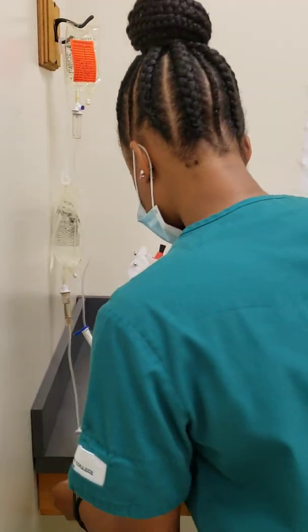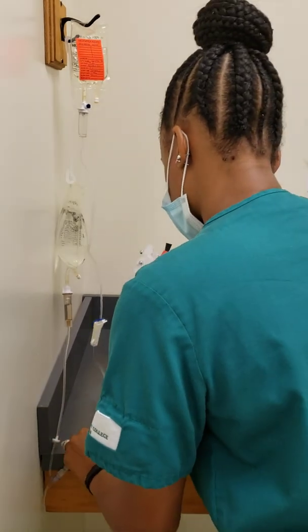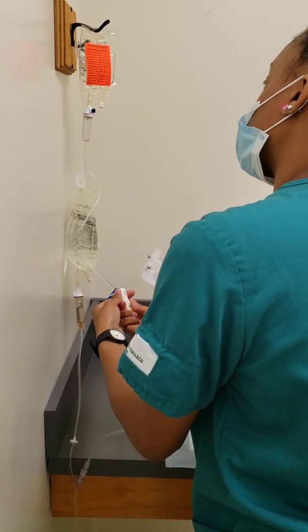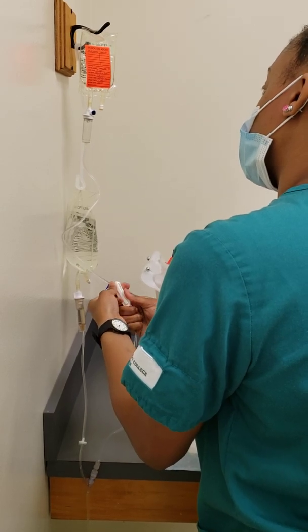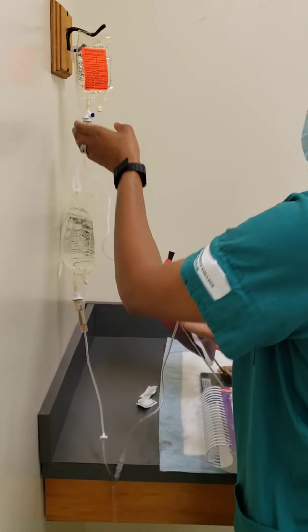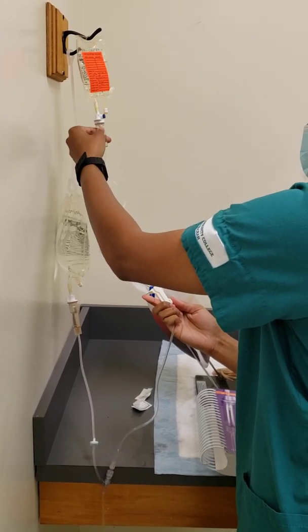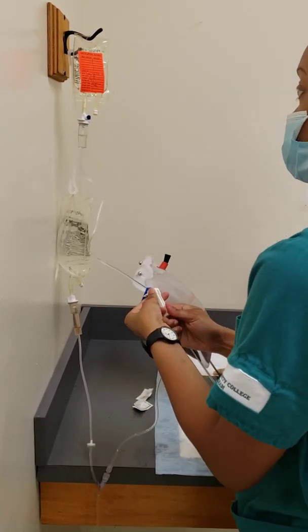Okay. And now what I would do is go ahead and regulate my drops with my primary. Make sure. And I never filled my chamber up. What I would have done was fill it up halfway so that it's filled.